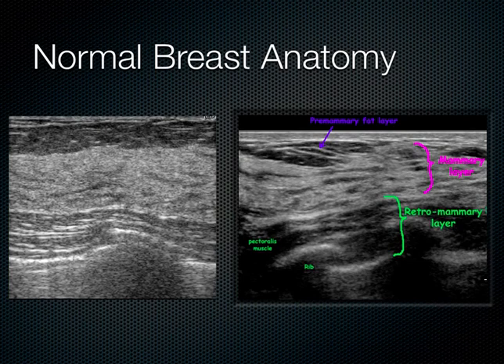Now, the normal breast anatomy is very simple, and like most glandular tissue, it has this very typical layering. So we can see really three main layers here. This is layer number one, the subcutaneous layer. This is just sort of subcutaneous fat here. And then, like all glandular tissue that we've seen on ultrasound so far, the thyroid, the testicles, things like that, it has this sort of appearance, relatively isoechoic here, with the different lobules of breast tissue. So that's called the glandular layer.